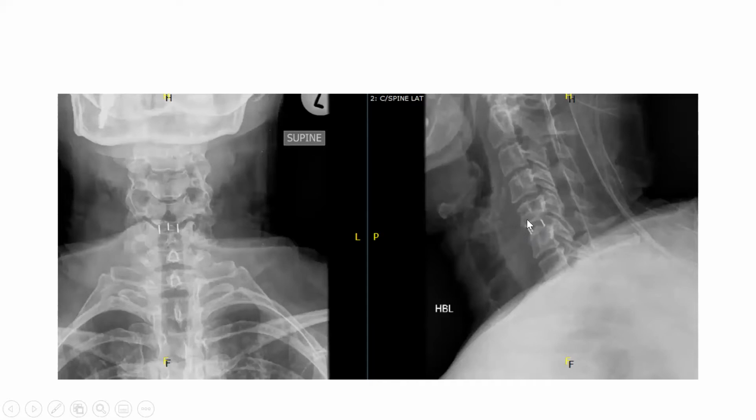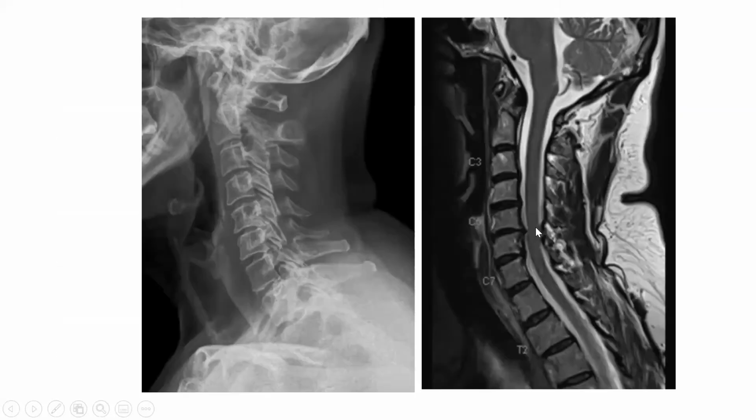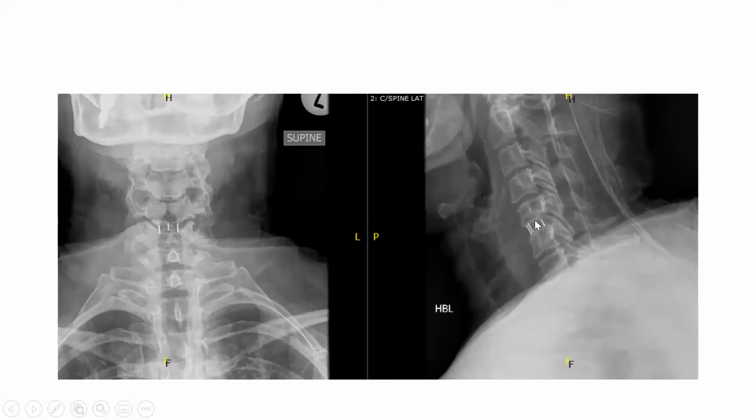This is a PEEK implant. These are little markings to show where the cage is, in terms of your placement on x-rays. And you look at the pre-op height, so it's quite narrow, about 3 mils. And you can imagine the foramen is coming out here. The foramen is closed down because it's lost height. By putting in the cage, you've jacked them up, you've indirectly decompressed the foramen, and you're also getting a solid fusion because there's autograft here. That's a typical standalone anterior cage in the cervical spine.